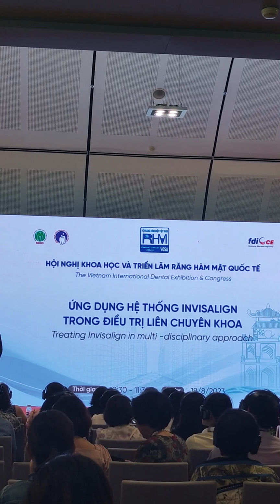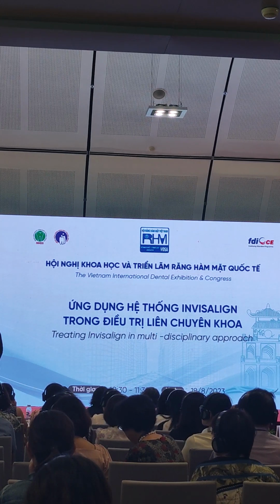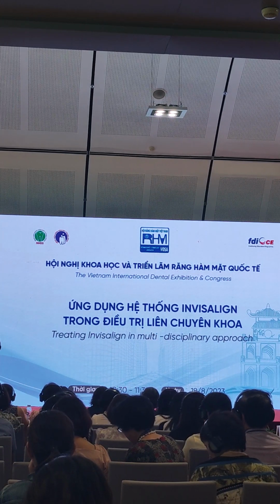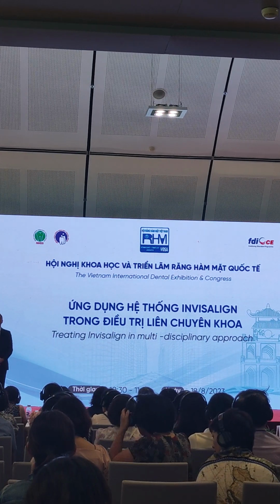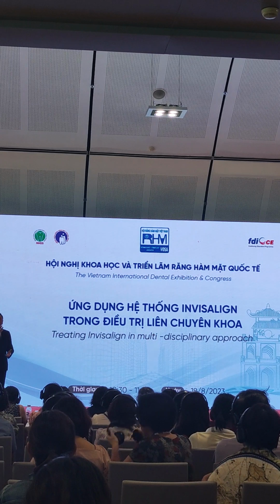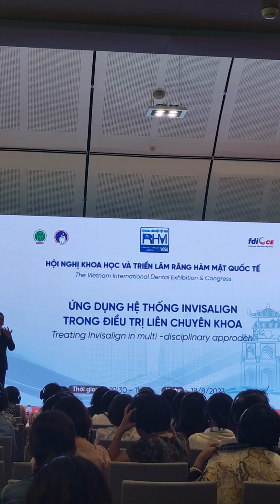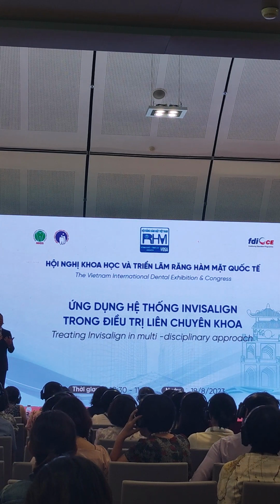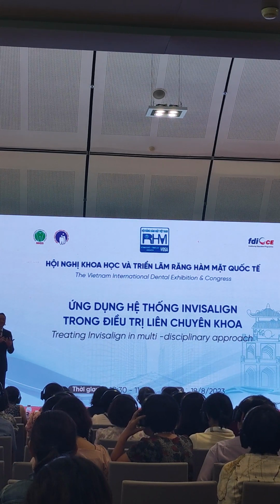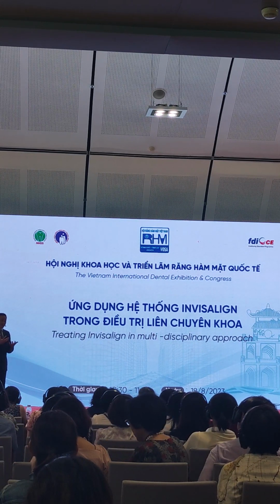And the most difficult part is the upper and lower molar intrusion. But going back to intrusion, if I do anterior intrusion, as long as you correct the crowding and inclination before you start to intrude, and you don't intrude 6 teeth together, intrude the incisors and then the canines, because incisors are easier.